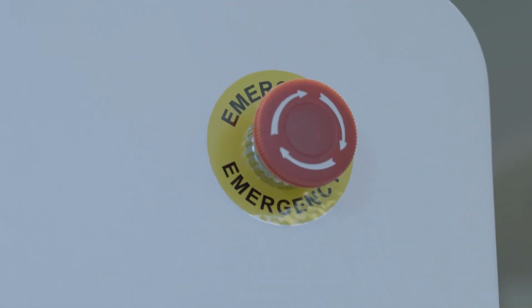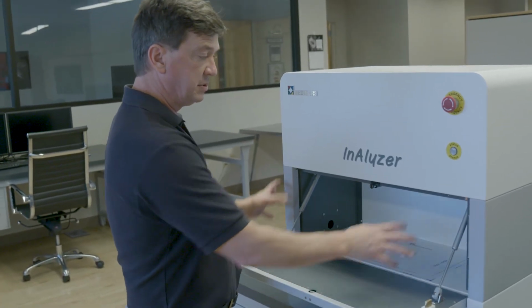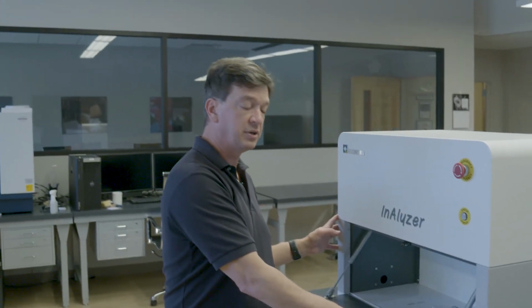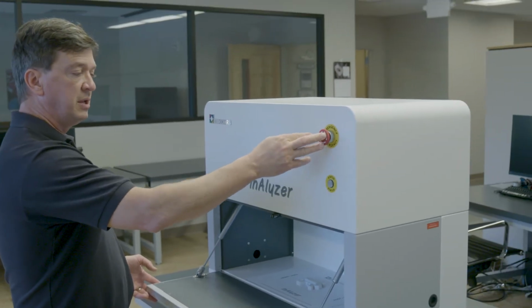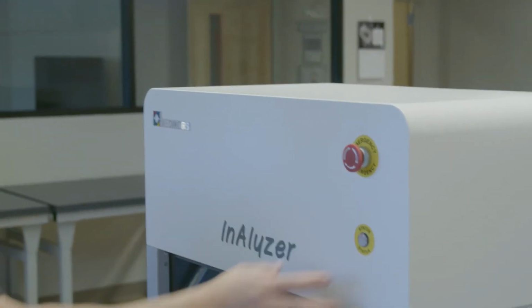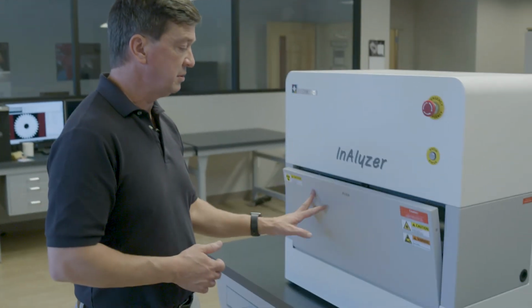So for safety, as I mentioned, it's a fully encased system, so there is lead behind these doors, lead throughout. There are interlocks so that if the door is open, the X-ray source cannot turn on. It physically disconnects. There is an emergency stop here, a status window to tell you when it's ready to scan, when the X-rays are on. And then for the anesthesia, it goes through the side, and there's a lead, basically an L or an S shape that it has to go through so that the X-rays cannot pass outside the system. We then just close the door, and we're ready to scan at this point.